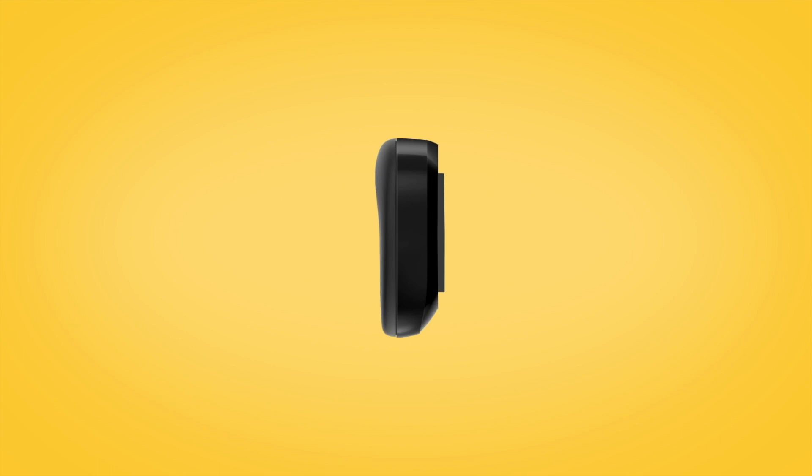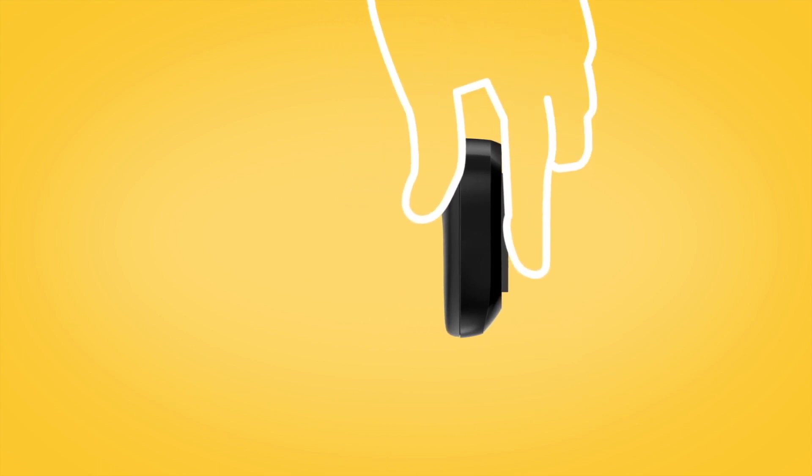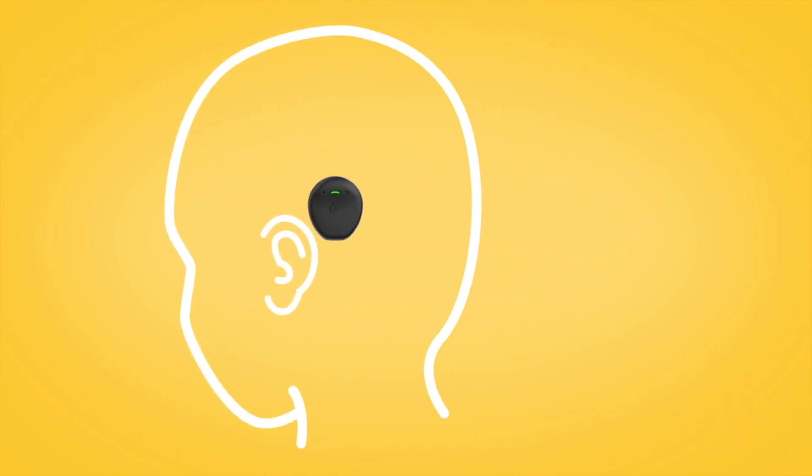To attach a softpad, peel off the single backing strip on the adhesive side of the pad, then attach the pad to the back of the sound processor and press down firmly. Then peel off the two semicircle backing covers on the cushion side of the pad and place your sound processor on your head as usual.